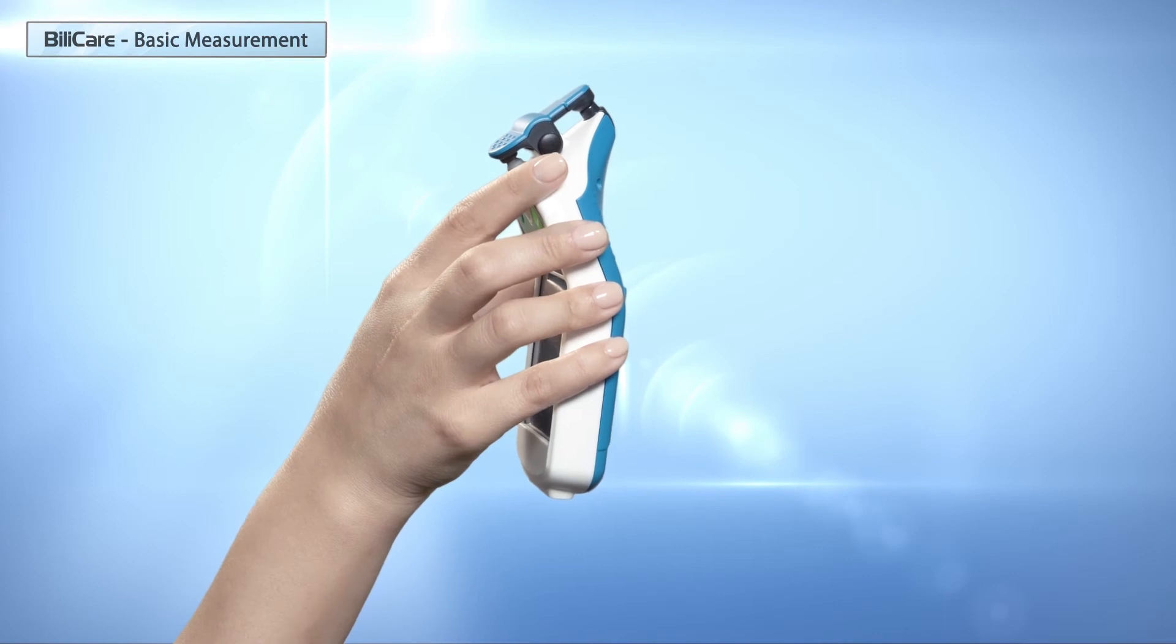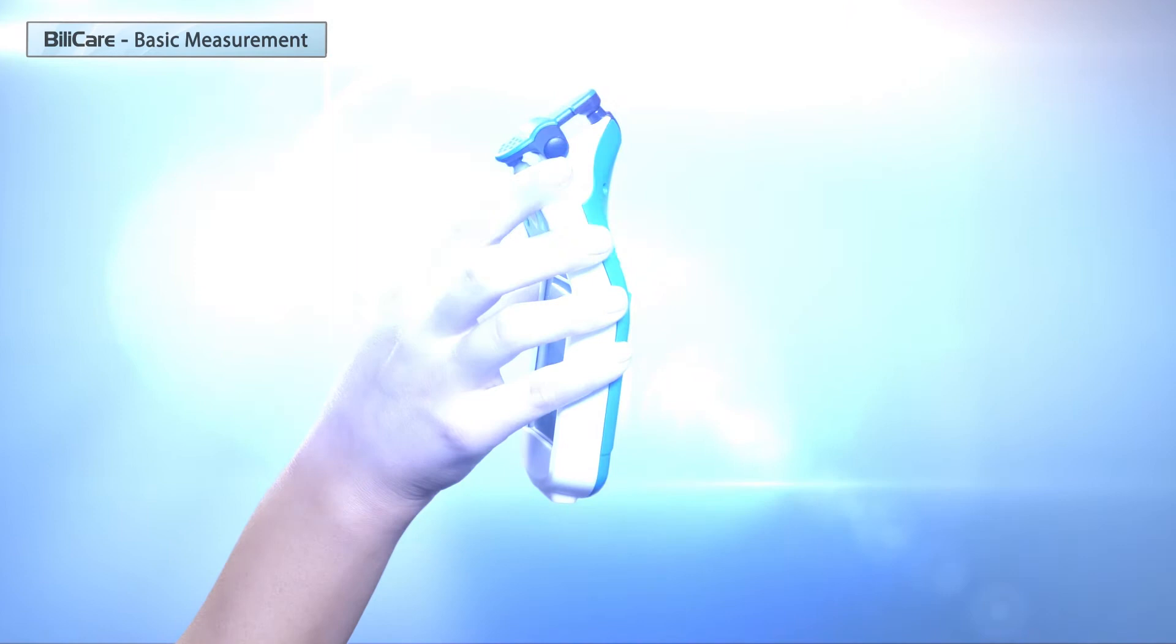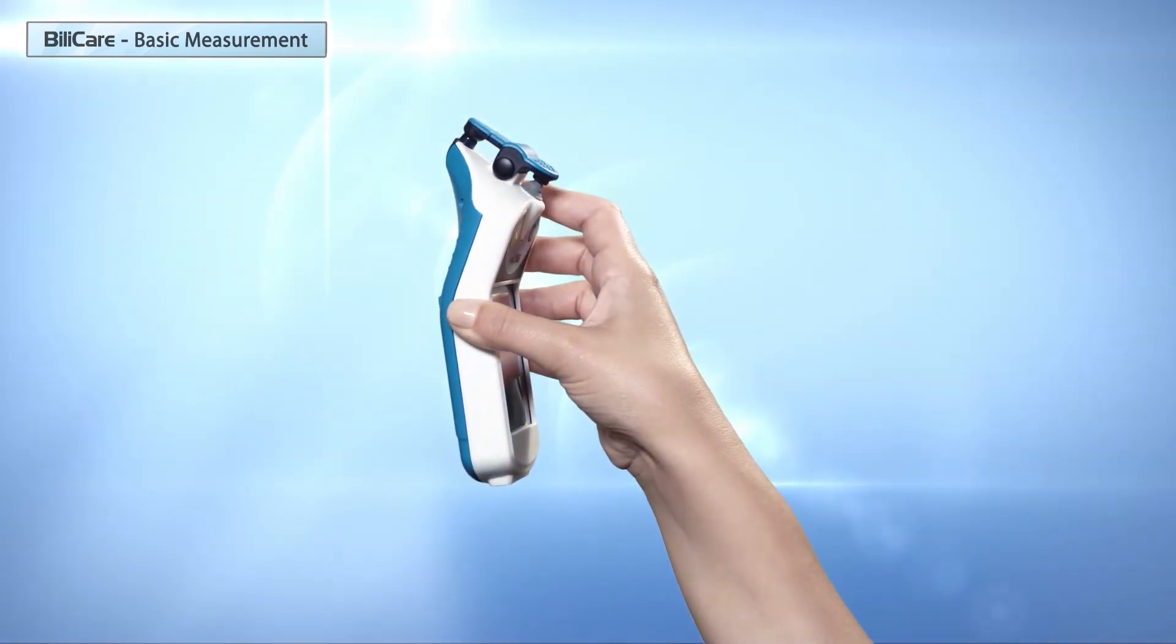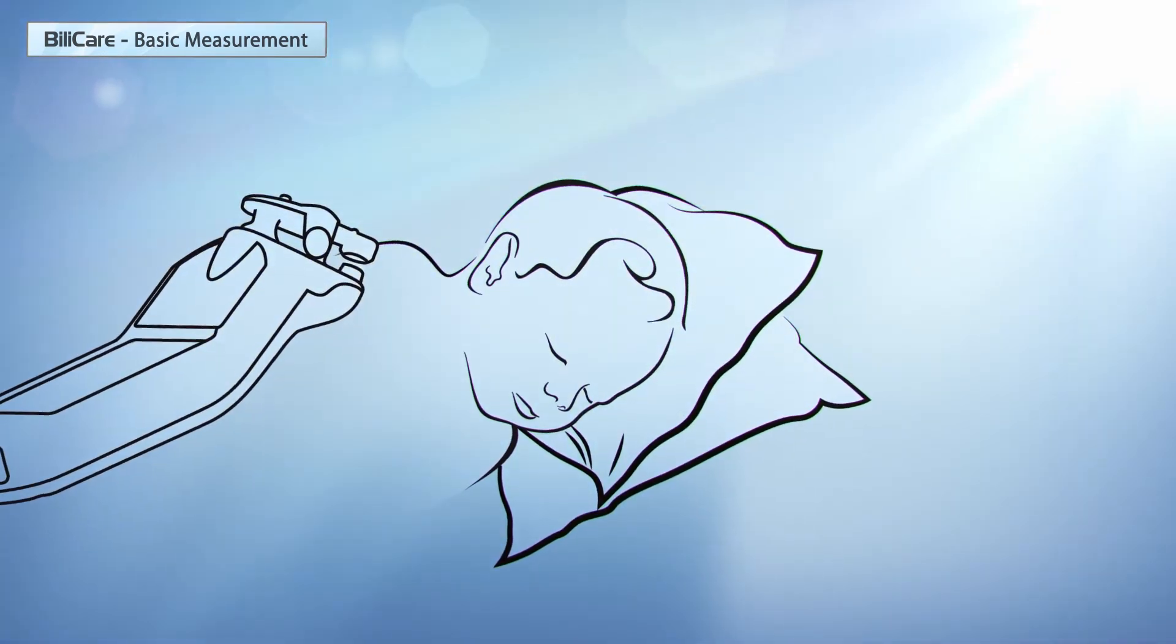During the measurement process, hold BILICARE with your middle, ring and pinky fingers on one side and your thumb on the other side. Your index finger will be used for pressing the clip's lever. You may use your other hand to hold the baby's ear.